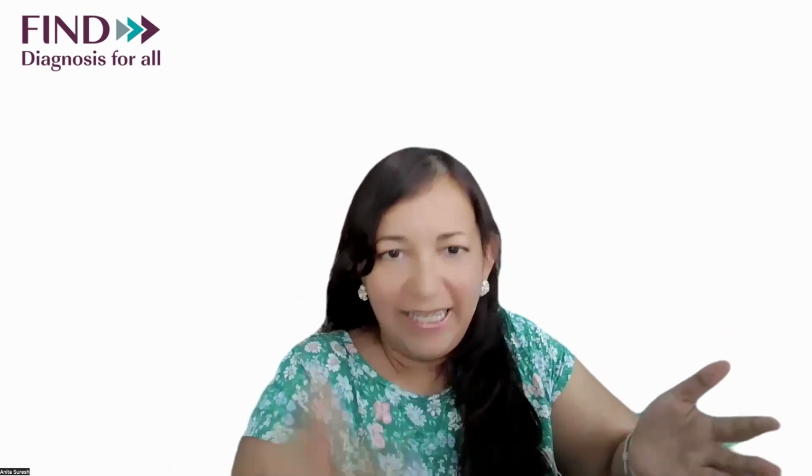What WHO typically does is a guidelines development group when it's a new test, a new class. So this was a first in class, and then they'll do the best in class. Anything that follows now will be a less onerous review. It'll be a technical advisory group review, which allows for, hey, we already know the basis. This is the foundation, the baseline. So do any new tests that come at least as good, or even better? That would be the basis they would use, as they did for Xpert.